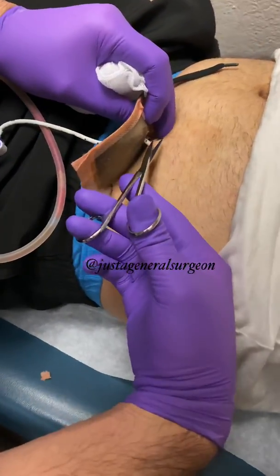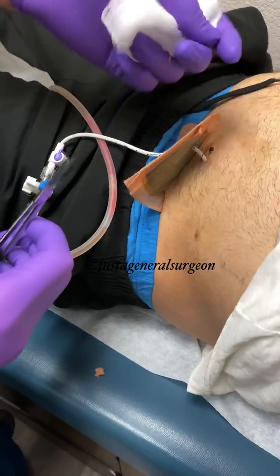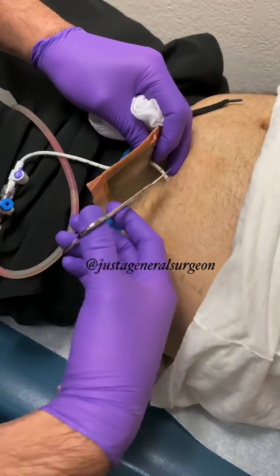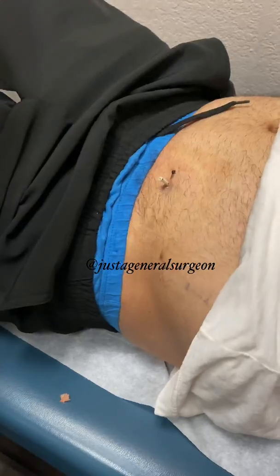We will remove that skin suture and then release the pigtail — it has a little something in it that keeps it curled up — by cutting it in half like that. This comes off so we can get rid of it.